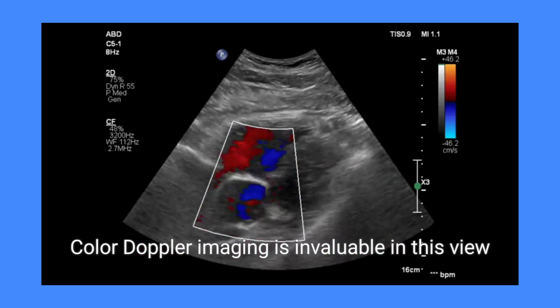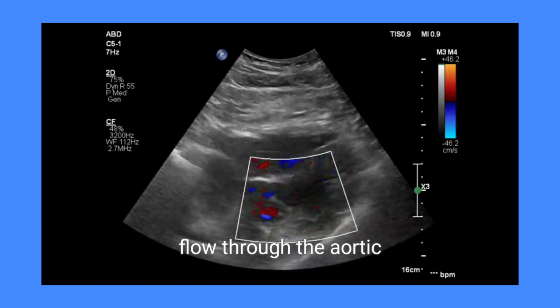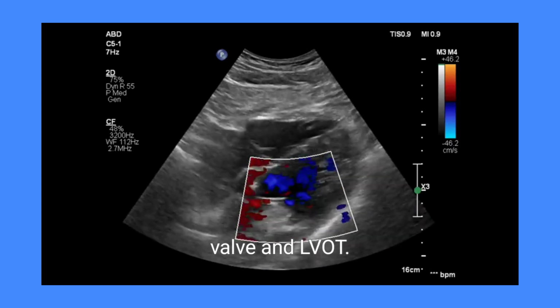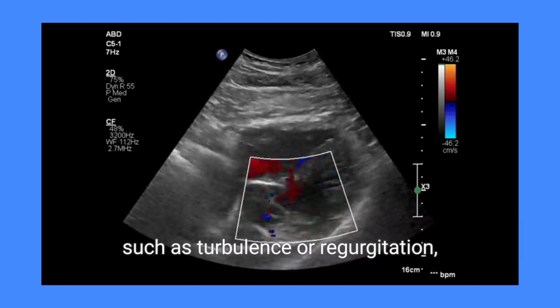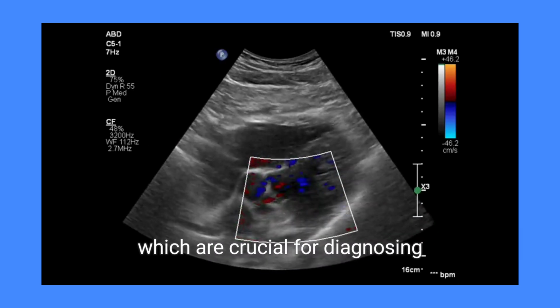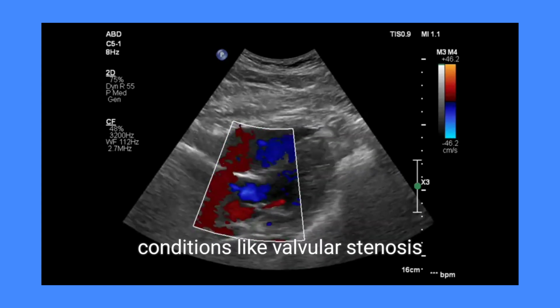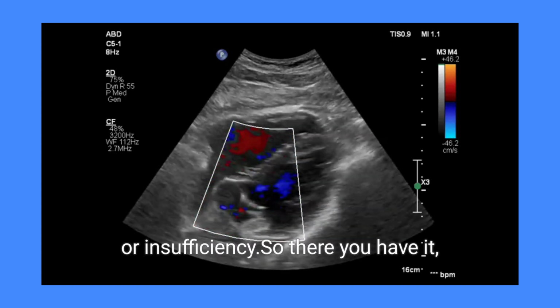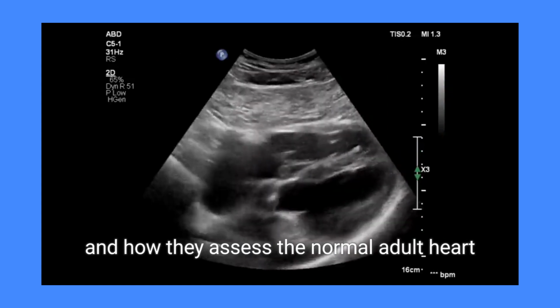Color Doppler imaging is invaluable in this view, as it helps visualize blood flow through the aortic valve and LVOT. It enables us to detect abnormal flow patterns, such as turbulence or regurgitation, which are crucial for diagnosing conditions like valvular stenosis or insufficiency.